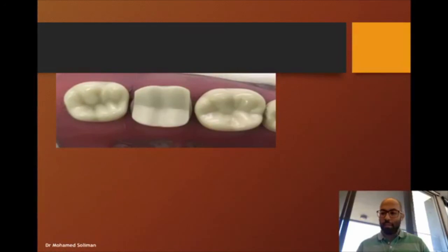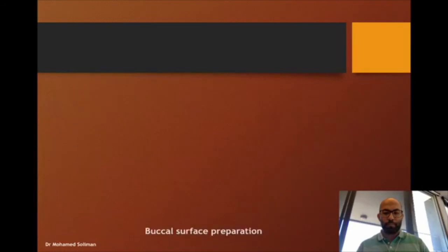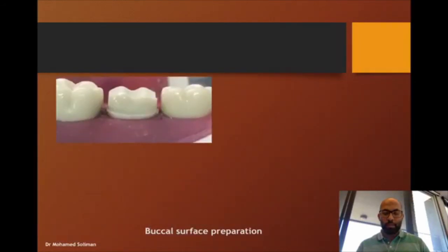So this is the next slide showing the initial proximal reduction. And then after I finish the proximal reduction, I move into the buccal, as I did in the videos. I usually mark a line first.